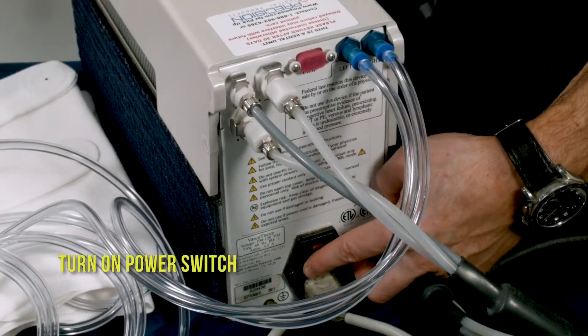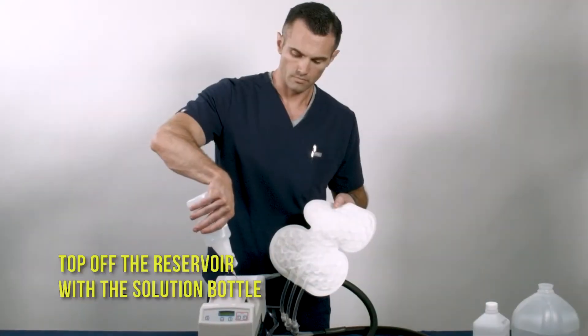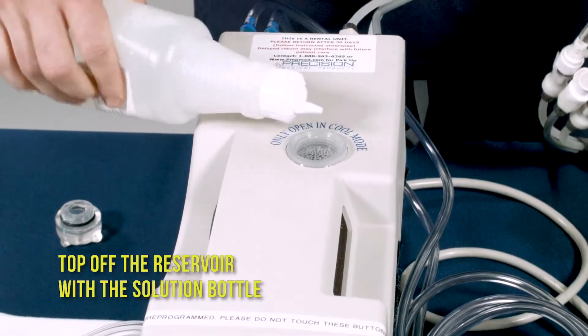Turn on the power switch. Top off the reservoir with the solution bottle.